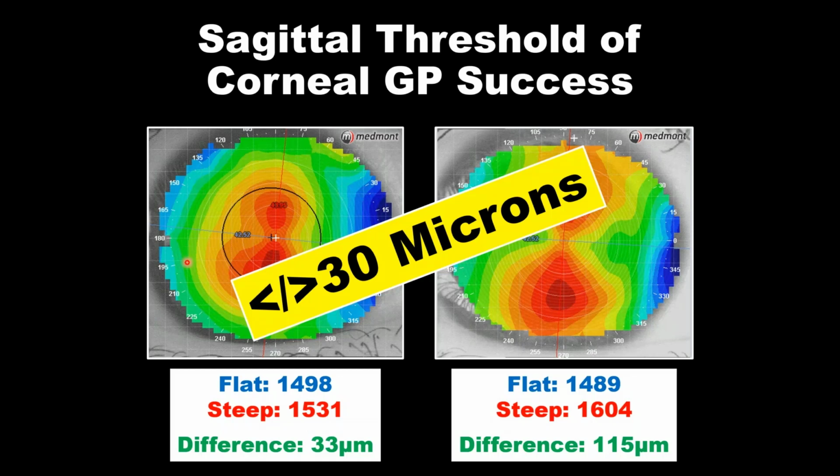In other words, when you have a toricity of peripheral cornea measured at 30 microns or greater, that's when you want to use a toric GP lens. Now, this is incredibly valuable related to orthokeratology lenses that need to center so well to provide the appropriate hydraulic forces centered to the pupil. So 30 microns or greater, use a toric landing.